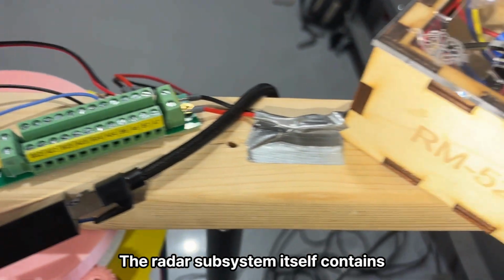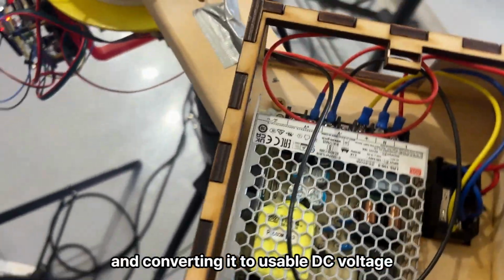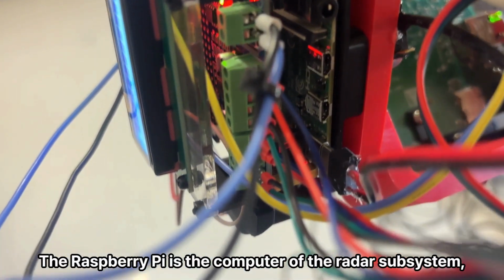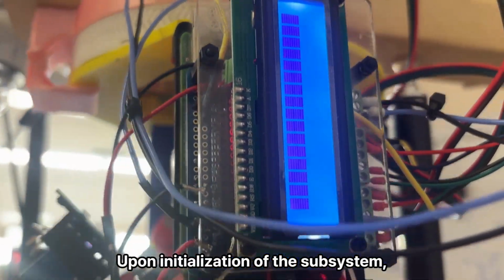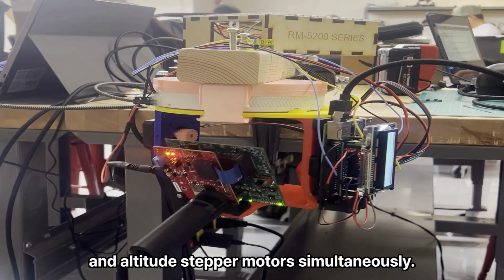The radar subsystem itself contains its own centralized power supply, taking in outlet AC voltage and converting it to usable DC voltage for the Raspberry Pi, stepper motors, and the radar. The Raspberry Pi is the computer of the radar subsystem, directing the motors and processing the radar data. Upon initialization of the subsystem, the Pi ensures the radar is set to a known home position via limit switches by rotating the azimuth and altitude stepper motors simultaneously.